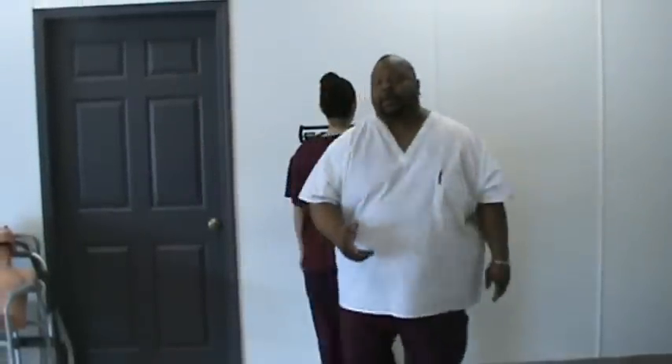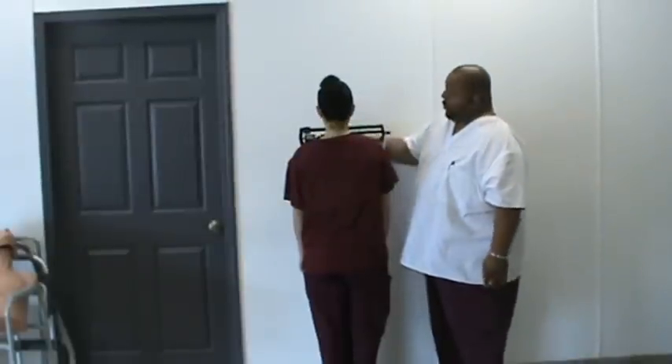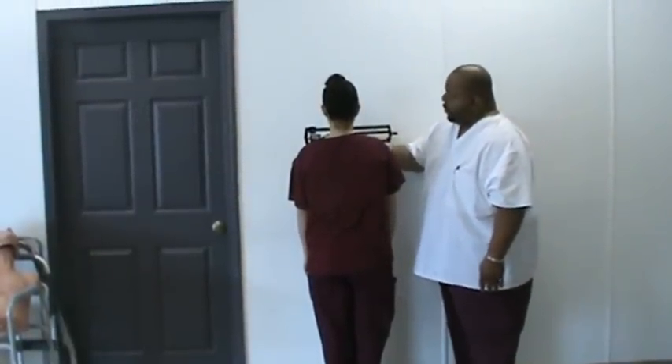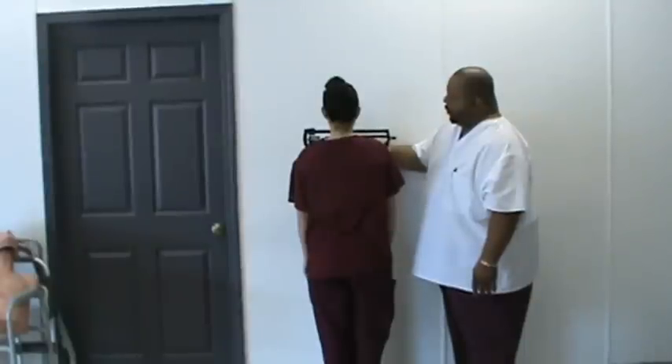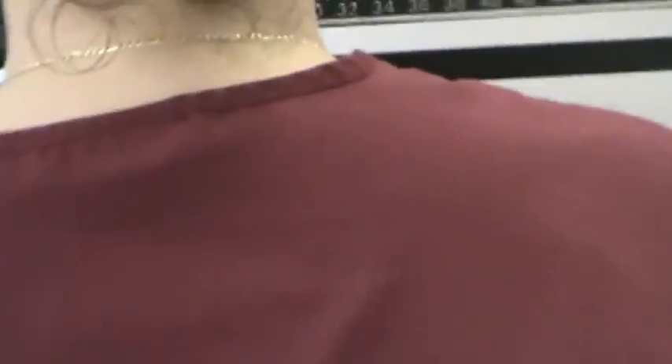First, what we're going to do is take the person's weight. We're going to zero everything out first. The bigger weight — the larger weight at the bottom — we're going to move over section by section until the hand goes down, and we're going to move it back to find your weight properly.